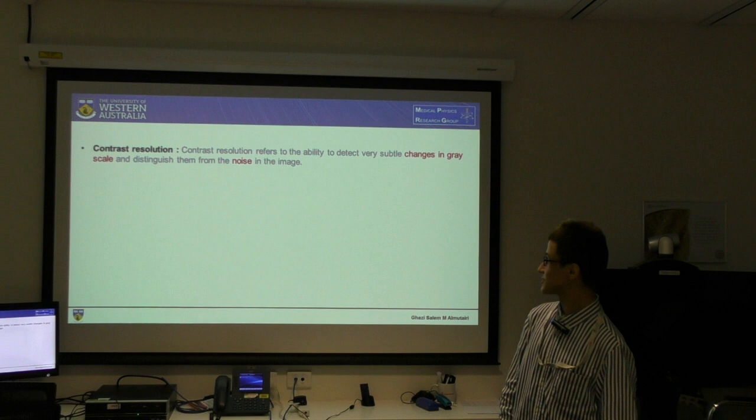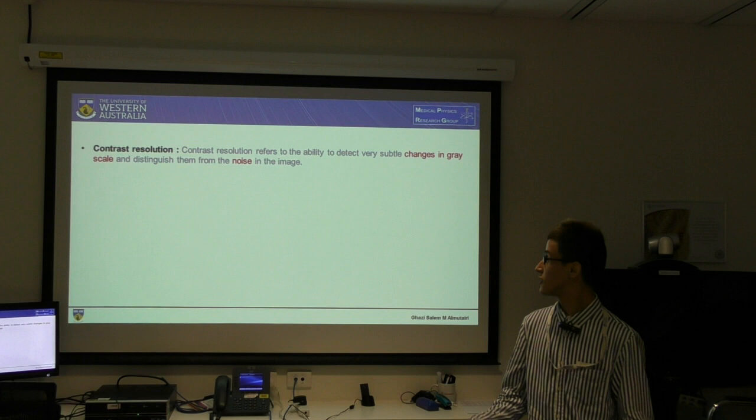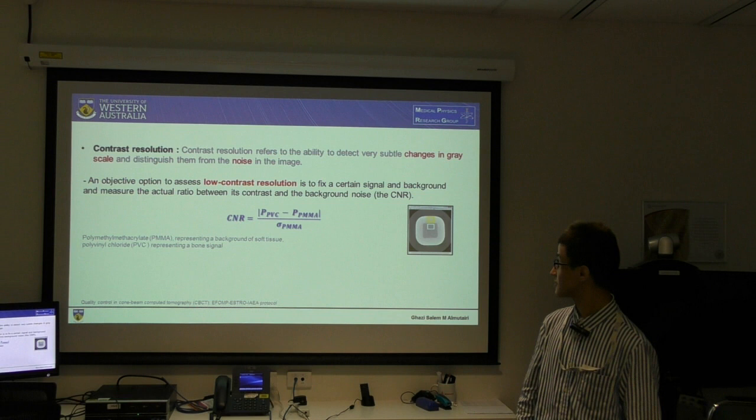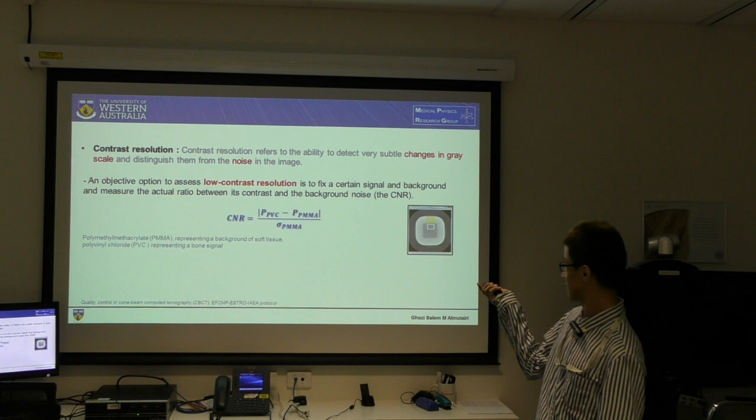Contrast resolution refers to the ability to detect very subtle changes in grayscale and distinguish them from the noise in the image. We have an objective option to assess the low contrast. It's to fix a certain signal and background and measure the actual ratio between the signal and its background, which is the contrast to noise ratio.